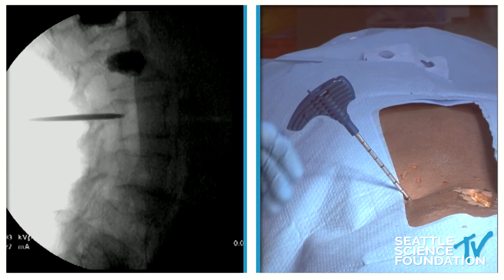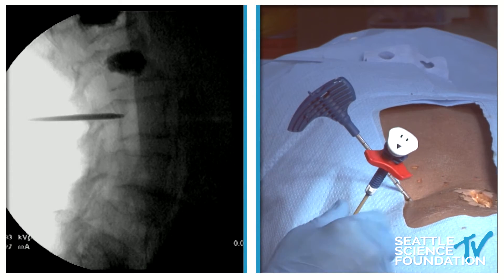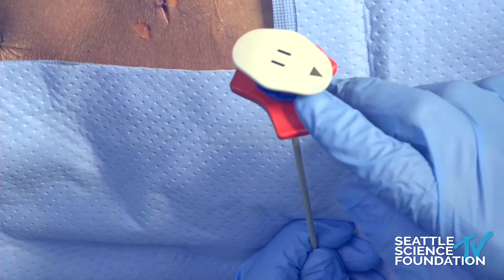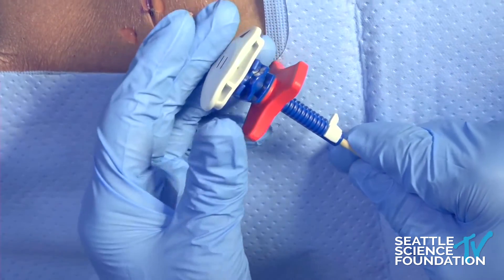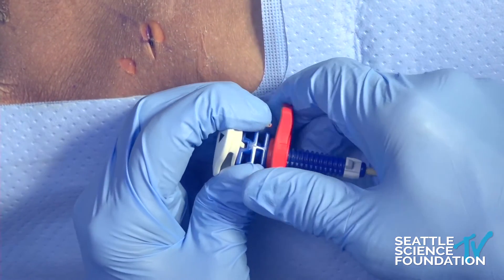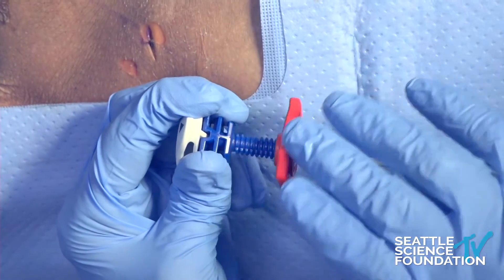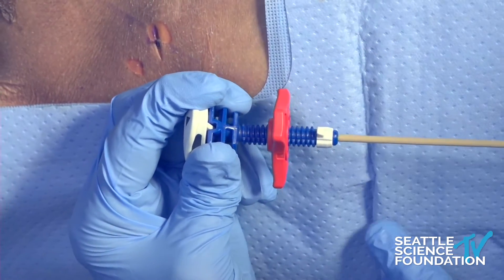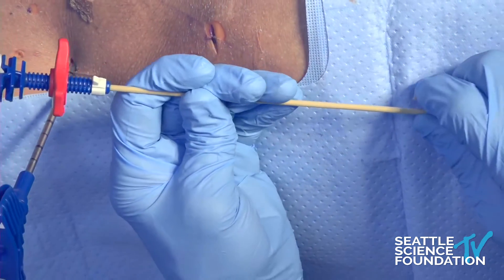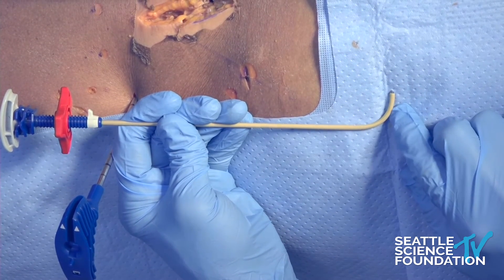I'll remove the stylet. This is the direction it's going on the proximal portion — we can see the direction of the stylet. There's a rotating wheel here, designed to protect against malletin it all the way down. You can advance the stylet to a predetermined amount of distance based on the wheel. This is the PEEK surrounding the nitinol stylet right at the distal tip.